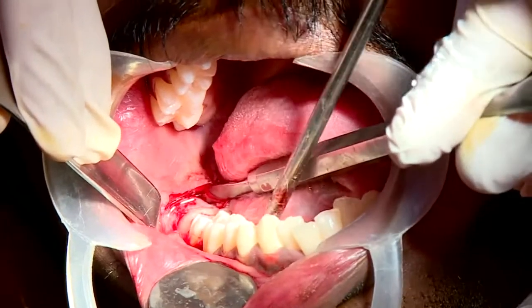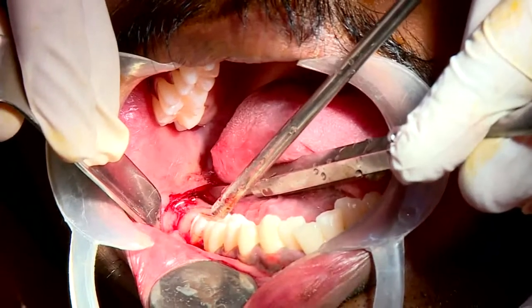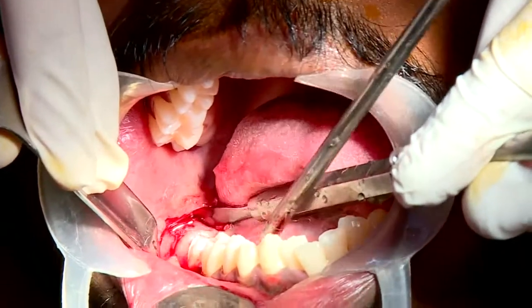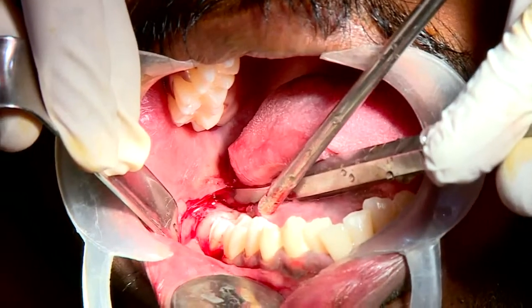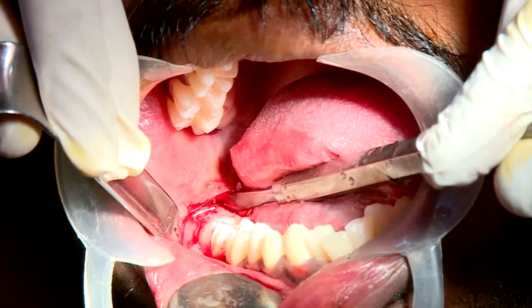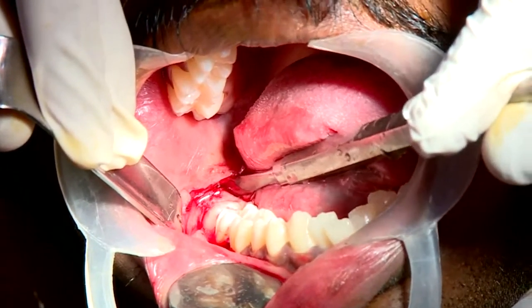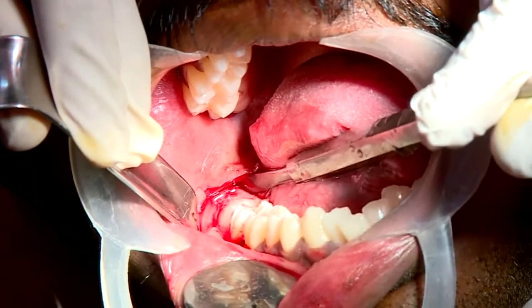So this is the cross-cut straight fissure burr 702. The length of the burr is 7 mm and the width, that is your diameter, is 1.5 mm. The speed I am going to use is 15,000 to 20,000 rpm.